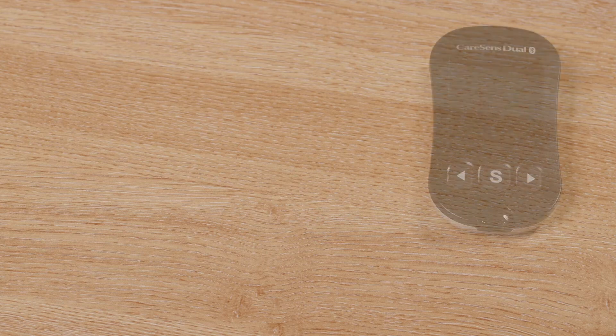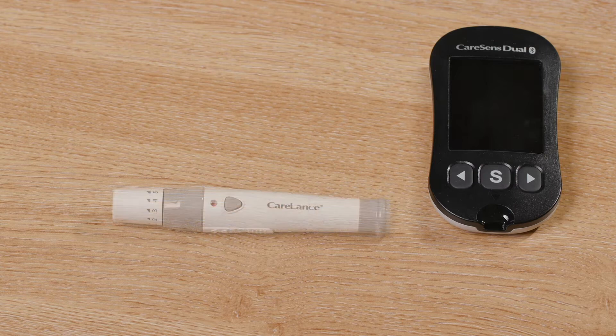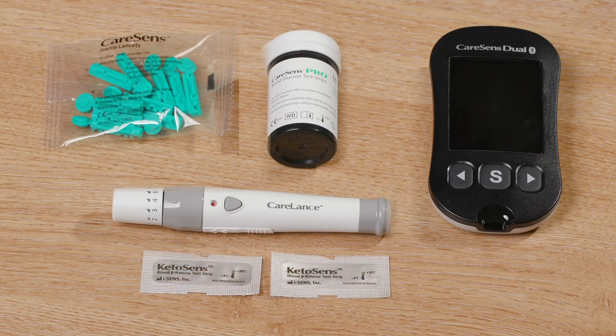Please unzip the pouch and remove the blood glucose meter, finger prick device, lancets, blood glucose test strips, and ketone strips.